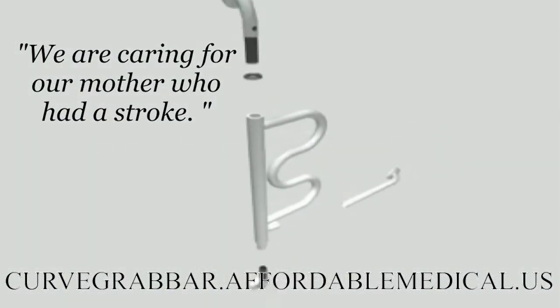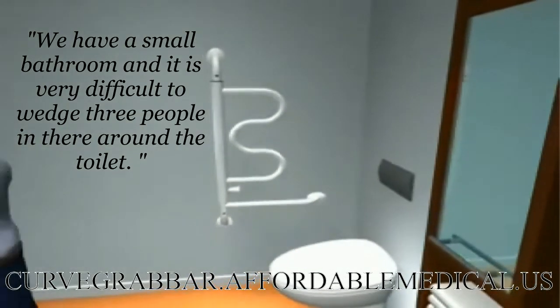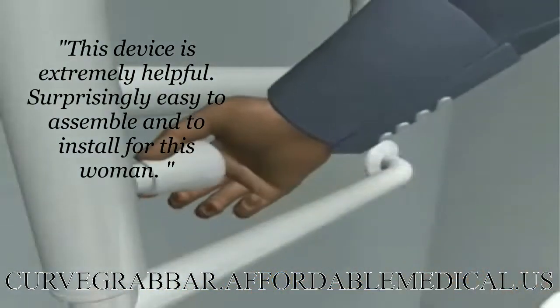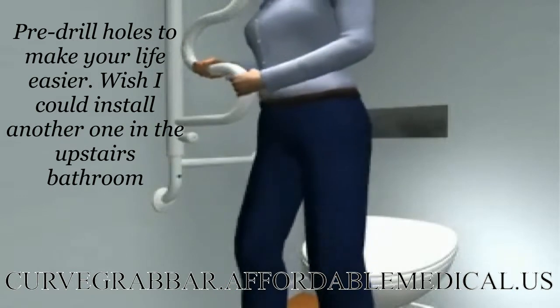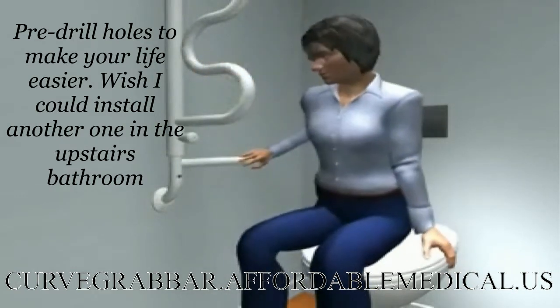We are caring for our mother who had a stroke. We have a small bathroom and it is very difficult to wedge three people in there around the toilet. This device is extremely helpful, surprisingly easy to assemble and to install. For this, pre-drill holes to make your life easier. Wish I could install another one in the upstairs bathroom.